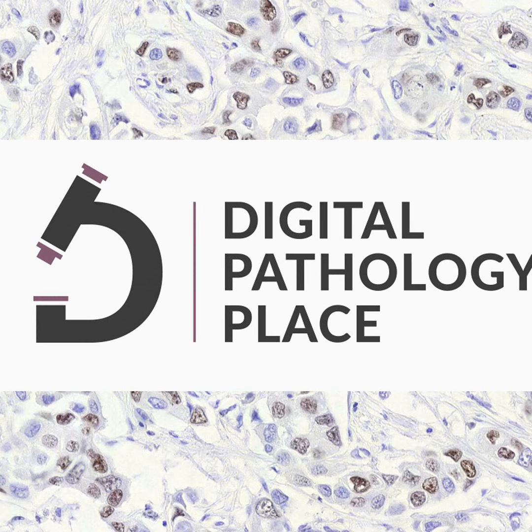And the advanced things that they did were not that advanced when it comes to computing, but definitely a lot more quantitative than what we do visually, right? So they observed general agreement between measures. They compared each measure to the others: the positive pixels, then the area stained, and then the cell densities. And they had a good correlation, general agreement between measures, which is good, especially if it's a cellular staining, but they have one caveat for the pixel quantification.